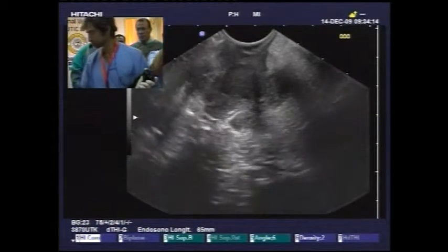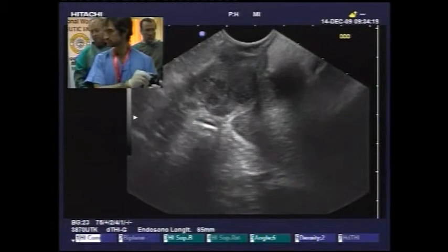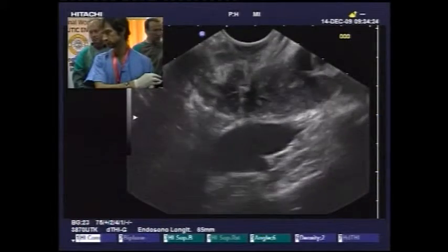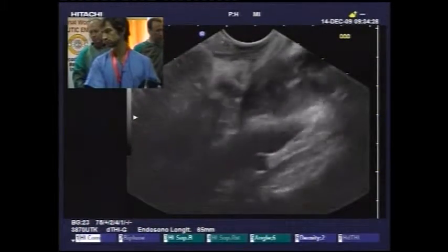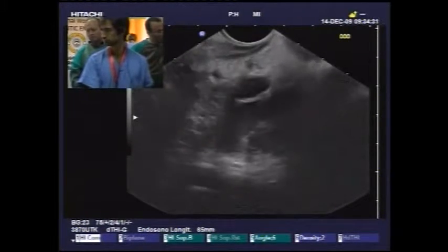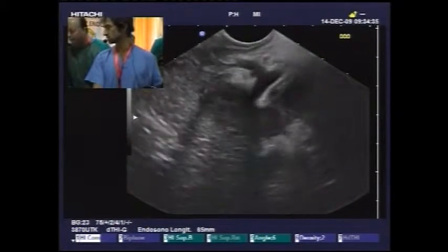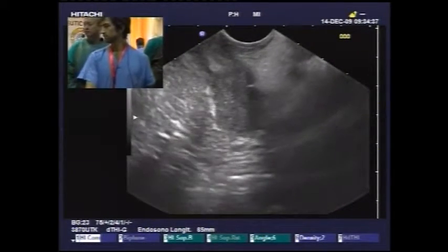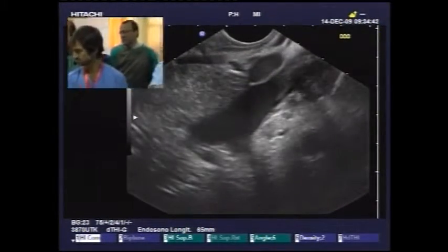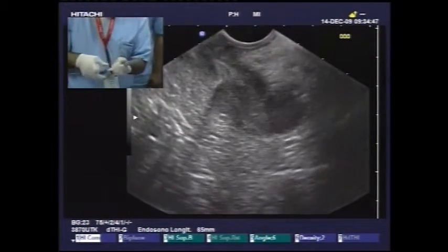Yeah, you can do that, but I think the problem is that stenting the pancreatic duct is not going to help so much because the stent will get blocked with so much very thick material. So I would think that once you put a nasocystic tube in the pancreatic duct, it is going to drain both the duct and the cyst, and we can irrigate this with saline solution and antibiotics to completely clear it. But we could put a stent and a transcystic tube also. What does the rest of the panel think, and what does the audience think?